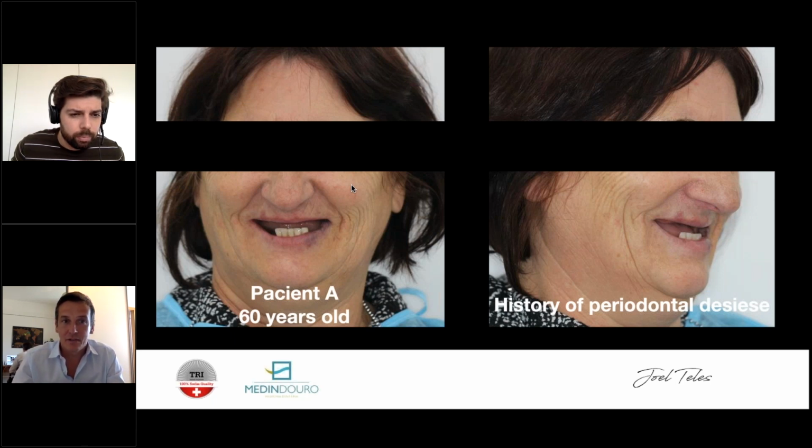And why aluminium? It's just because you can mill aluminium very much faster than any high quality materials. So the milling centers provide this very cheap. It's much cheaper than creating anything out of zirconia or whatever, even titanium. The milling machine is much quicker to mill it, and it's really only to check the fitting, the passive fit of everything before creating the full final restoration. I hope this answers your question.